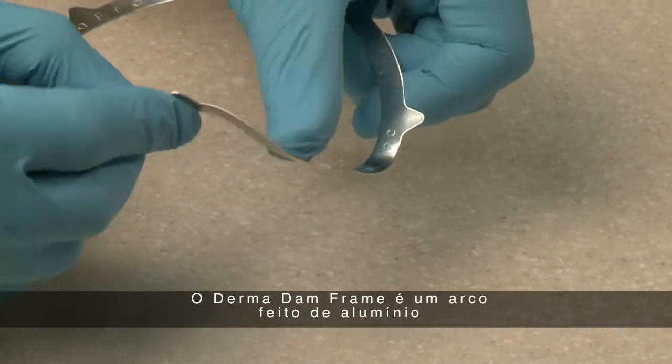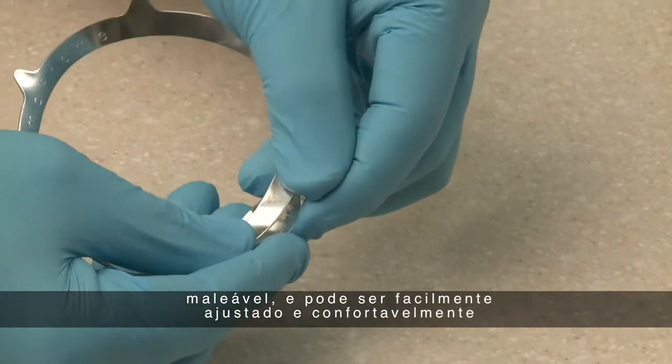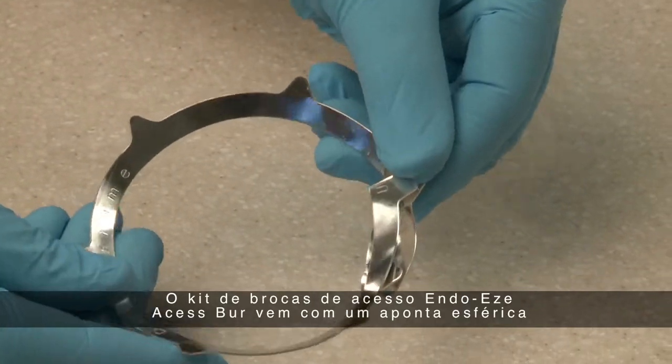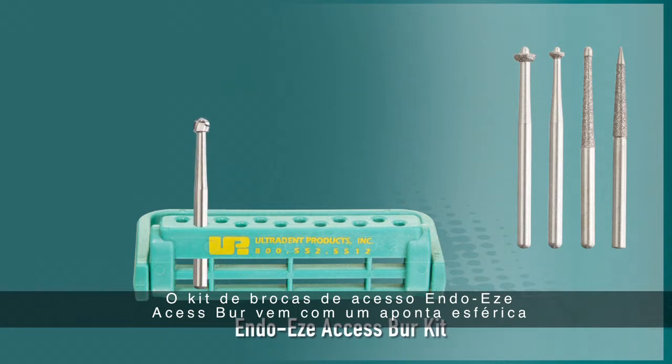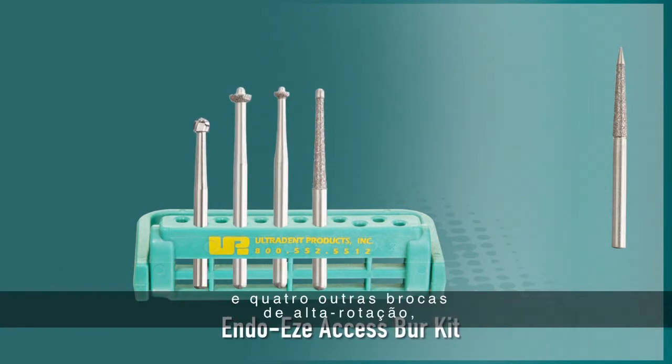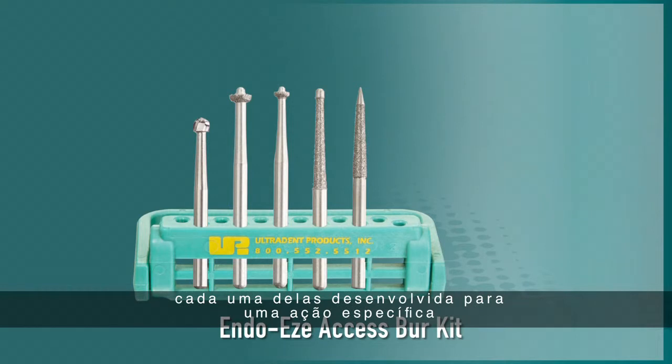The Dermadam frame, made of a malleable aluminum, can be easily adjusted and comfortably shaped to each patient's mouth. The EndoEase Access Burr Kit comes with a round burr and four unique high-speed access burrs, each designed to perform a specific role in safely creating pulp chamber access.